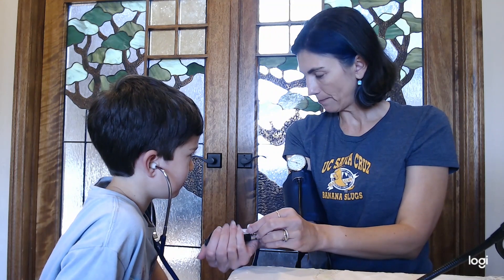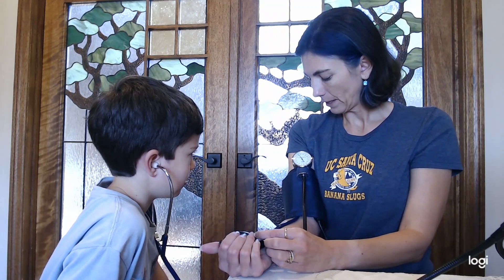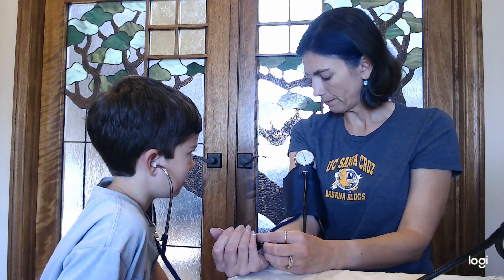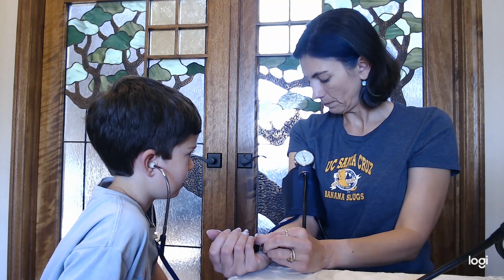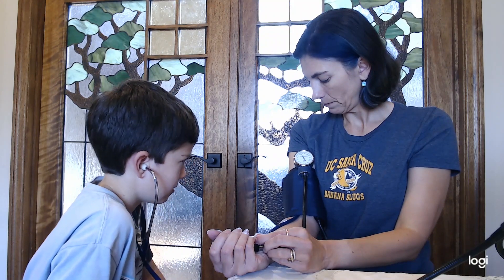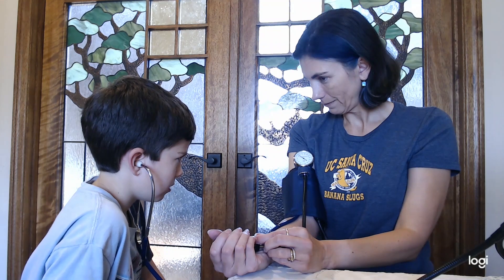See how the numbers are going up and the gauge is going up? 140. Hold on — there's no sound yet. No sound.